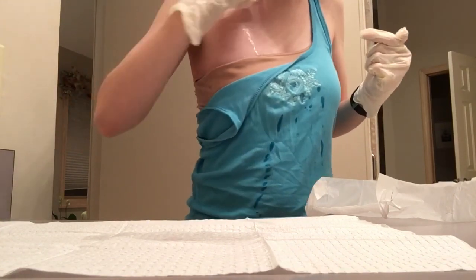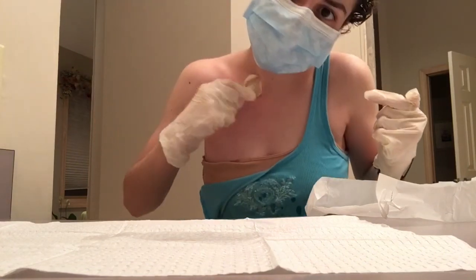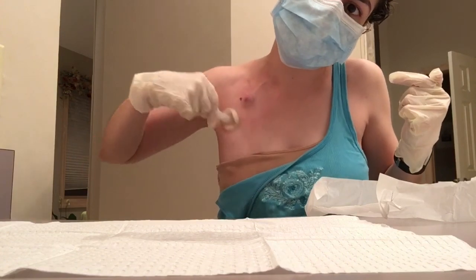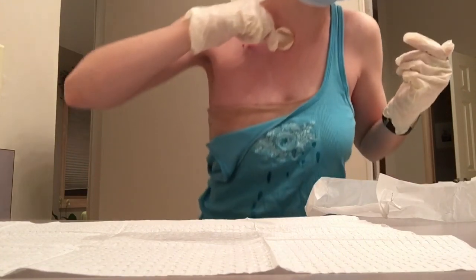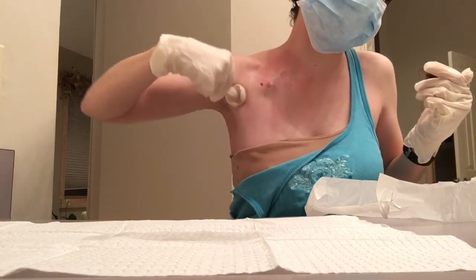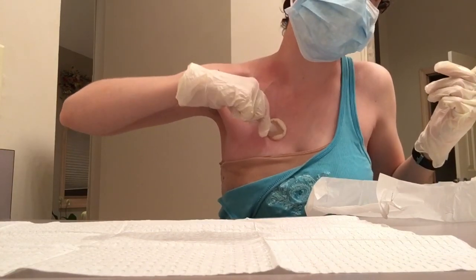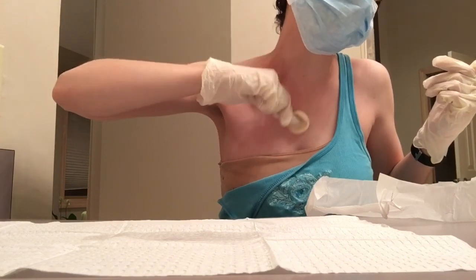And I'm gonna go in circular motions and make sure it's really wet and press with a lot of pressure and get really far away from the port too, because then it helps the dressing to stick really well. And I actually had a bit of trouble getting my dressing off today to shower because it was on so good, which is a good thing.